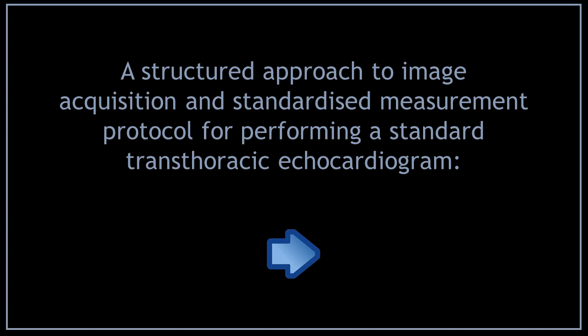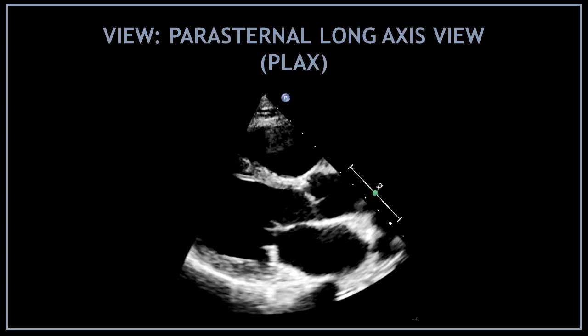Next, I'm going to show you a structured approach to image acquisition and standardized measurement protocol for performing a standard transthoracic echocardiogram. In part one, I'm going to show you the minimum data set you need to obtain from the parasternal long axis view.